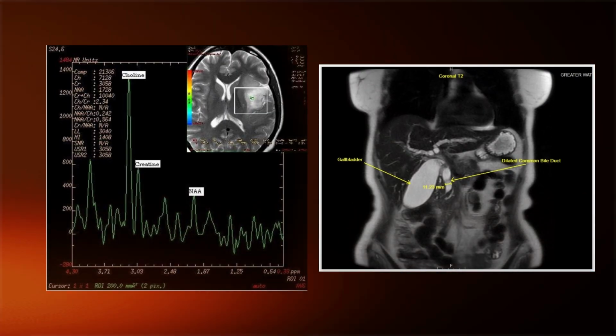This makes it a bit more expensive, not only to purchase, but also to run. Claustrophobia is one thing that the closed MRI poses, and of course it is more prone to accidents because of the high magnetism. But images like the spectroscopy are ably done on a closed MRI.